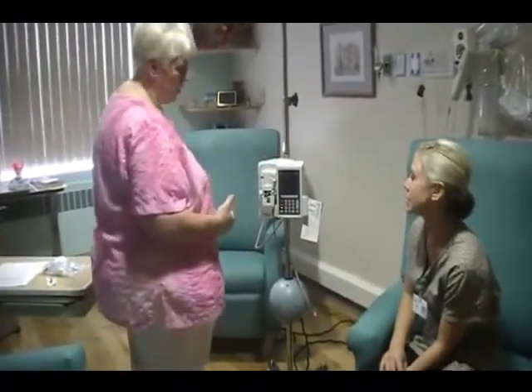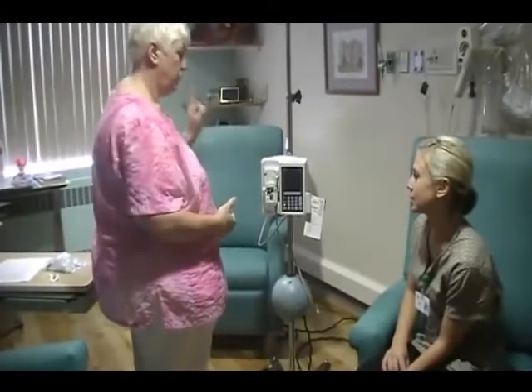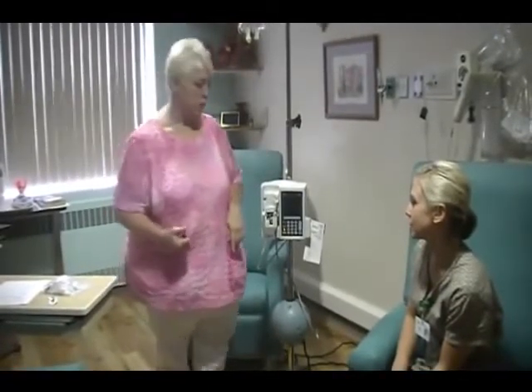First of all, we need to know that these pumps always have to be plugged in. If they're not plugged in, they lose their charge, then we have to send them to maintenance and it takes a pump off the floor and causes a lot of problems.